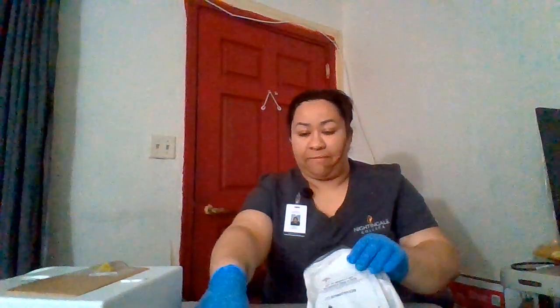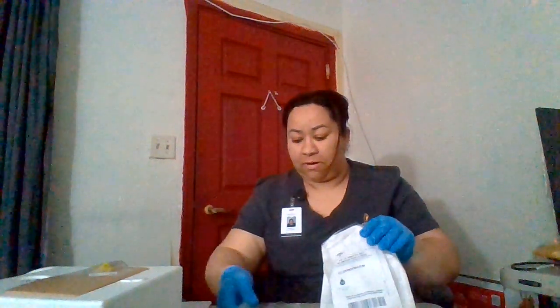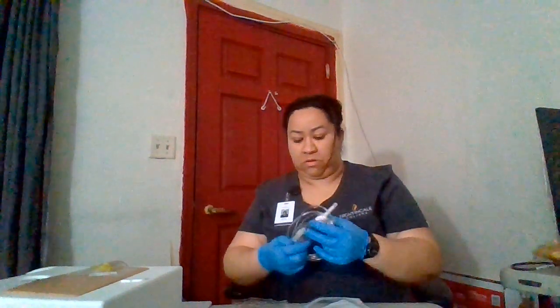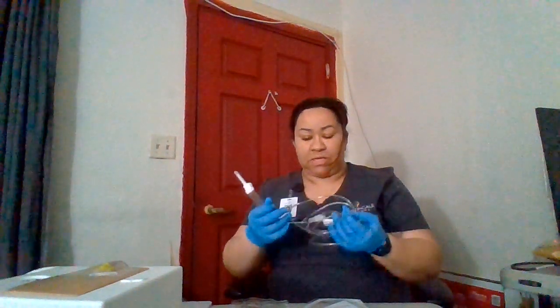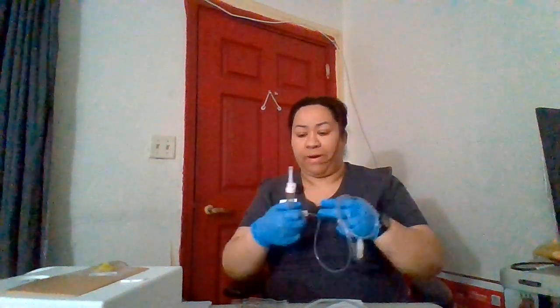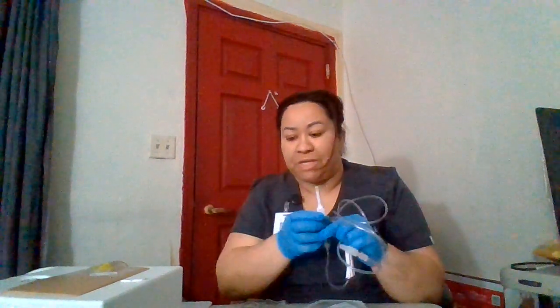Okay, so I'm going to start off by preparing my spike and fluids here. This is our primary tubing. In our primary tubing, you will find the spike, and the spike needs to be kept sterile. It cannot be touched. This is actually what's going to be introduced into our IV fluid bag.